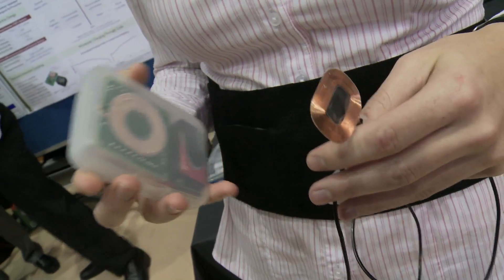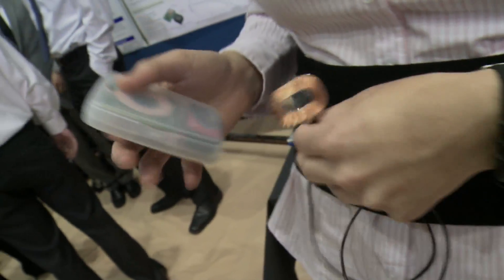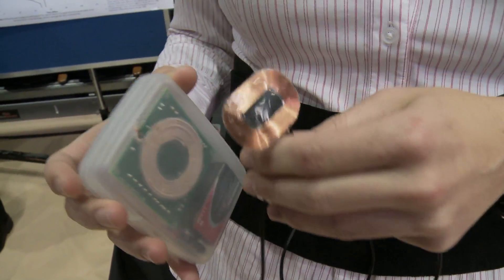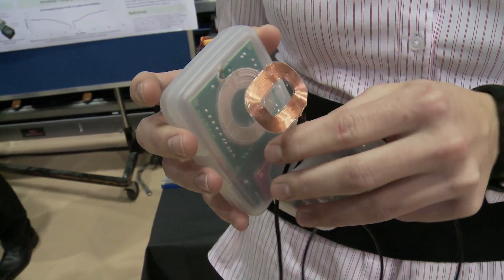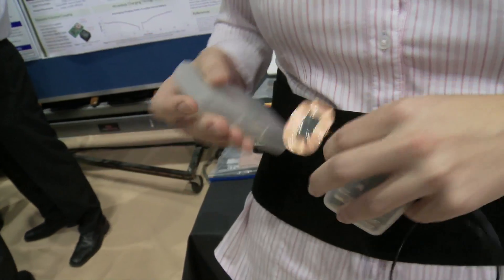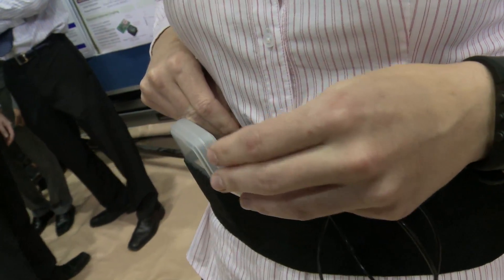This is a model of what our prototype would actually be when it's miniaturized and ready for implantation inside a human. This device is worn on the outside of the patient, and a current is sent through this coil. Using magnetic coupling, it's able to transfer power from this external coil into this coil right here, which would be implanted just a centimeter underneath the skin.